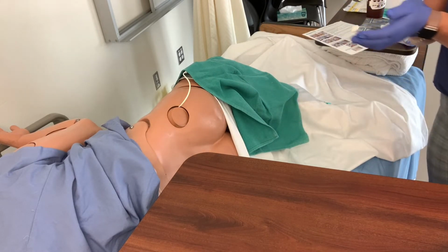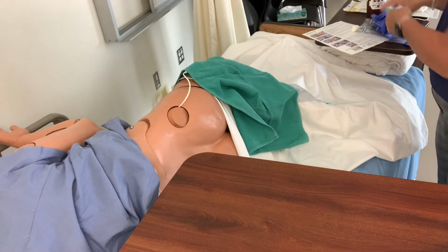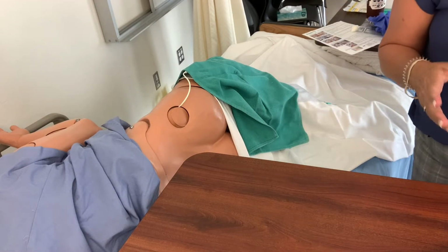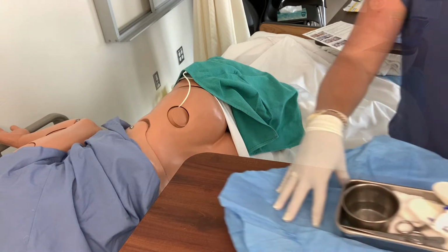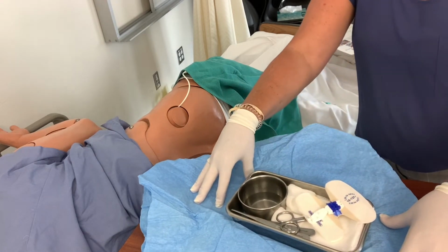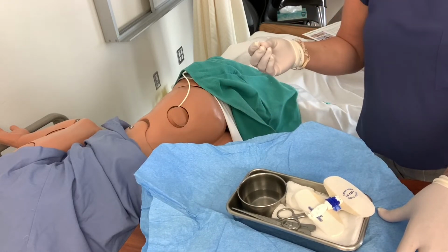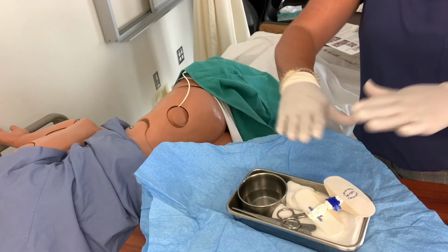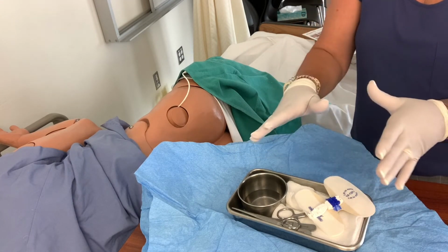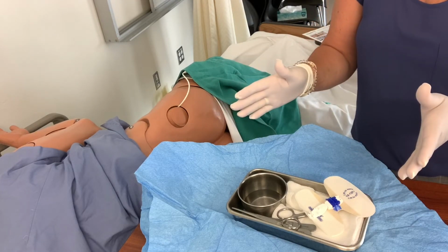I'm going to get rid of my blue gloves, and because this is a sterile dressing, I have set up my sterile tray. I've opened my sterile tray, I've added all the supplies that I need to add, and I'm now going to put on sterile gloves. Got my sterile gloves on, and I'm just going to walk this over where you can see it a little bit better. So after I took the dressing off, I opened up my sterile field, I added my sterile saline, but I left all the utensils on the inside because it's a sterile dressing, so I cannot put them on the edge because they become contaminated.